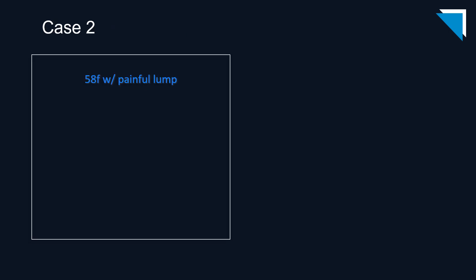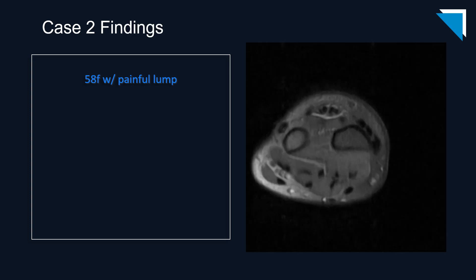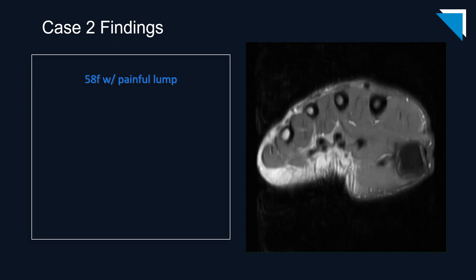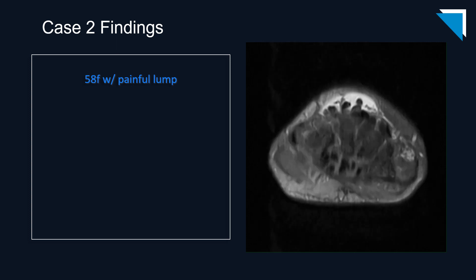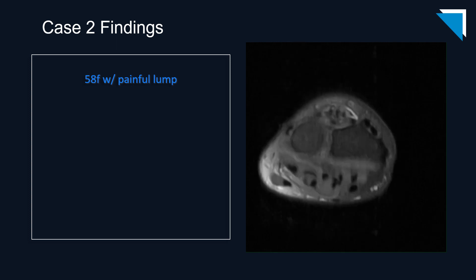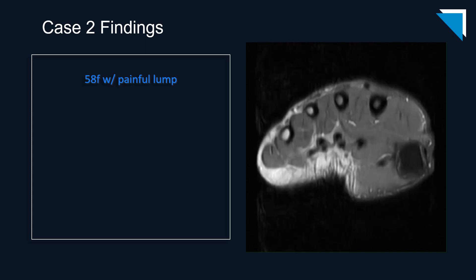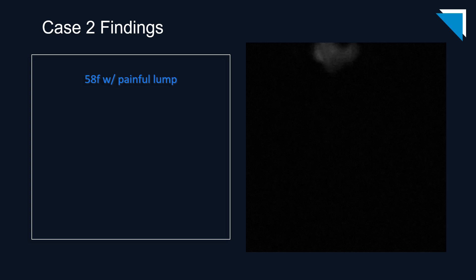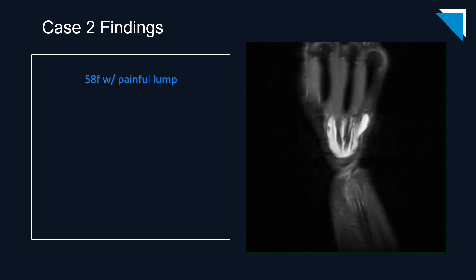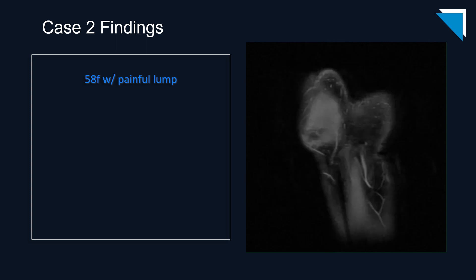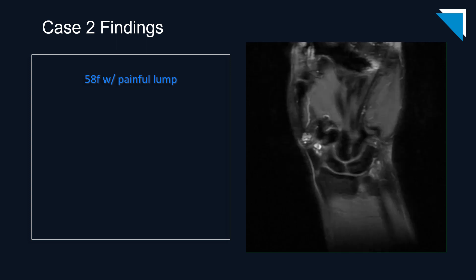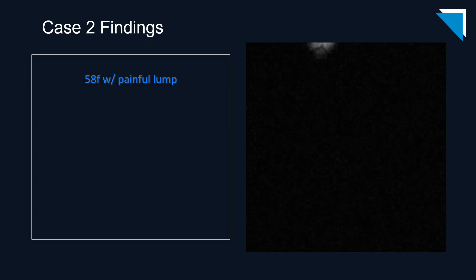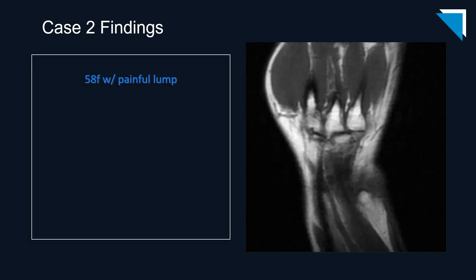Our next patient is a 58-year-old woman with a painful lump. Let's begin by scrolling through these axial fluid-sensitive images. I'll direct your attention to the dorsum of the wrist — it's not a subtle finding. These are the coronal fluid-sensitive images from the same patient. Feel free to pause the video if you want to scrutinize a particular area. And finally, the coronal non-fat-suppressed T1-weighted images.